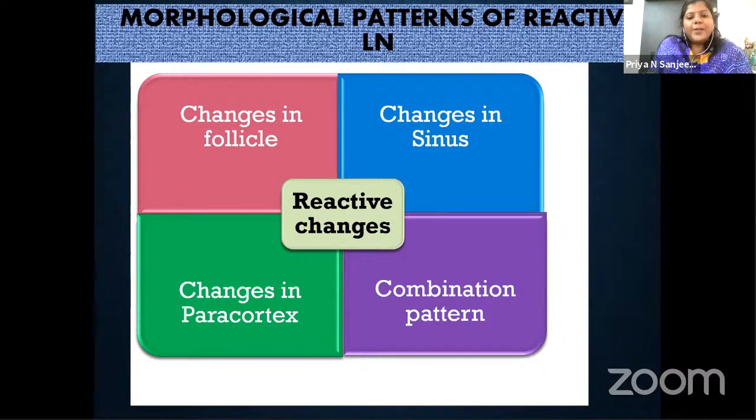Coming to the important segment of the lecture, identification of reactive lymph nodes. So reactive is the term used whenever there is a reaction or a response by a host due to inflammation in absence of neoplasia. So now we know the normal histology of a lymph node and the histological components of a lymph node, and it is easy to evaluate the reactive changes in a lymph node.